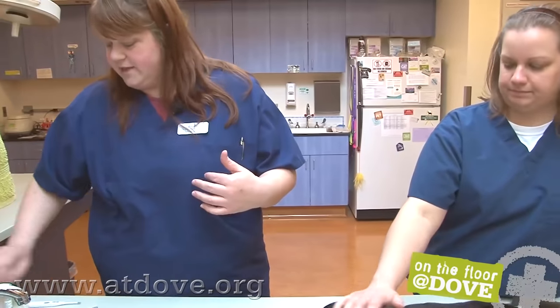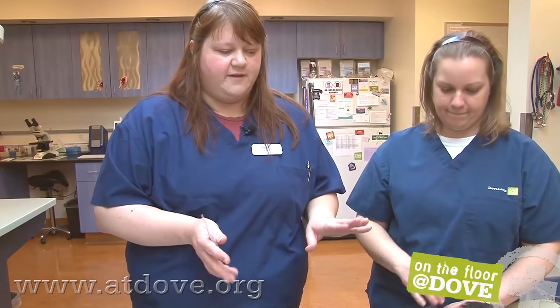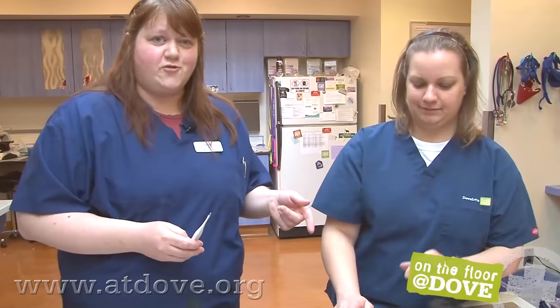Because he's current on his exam, all he needs is a tech appointment with a vaccine, so we're just going to take his temperature and make sure he doesn't have any kind of fever. We'll see if Megan can restrain this baby.